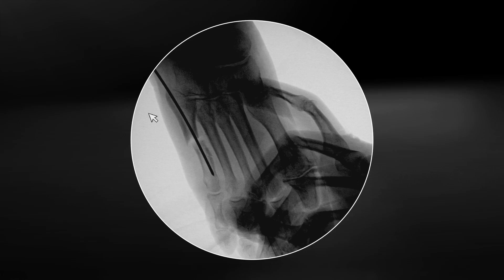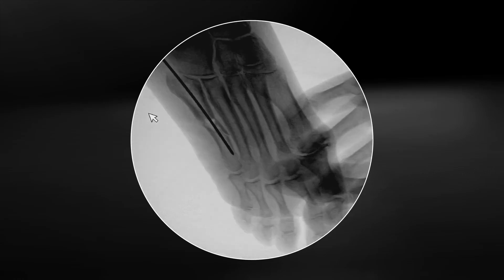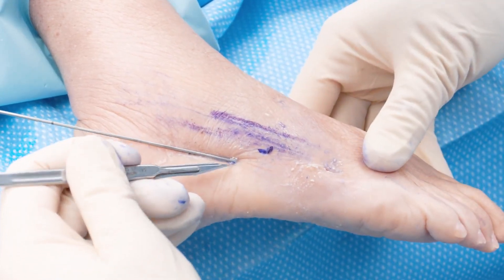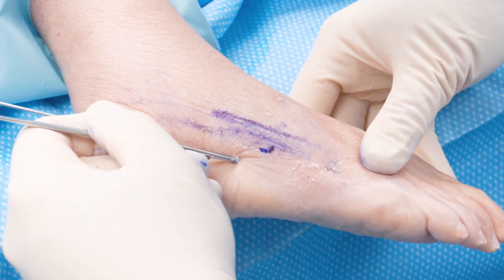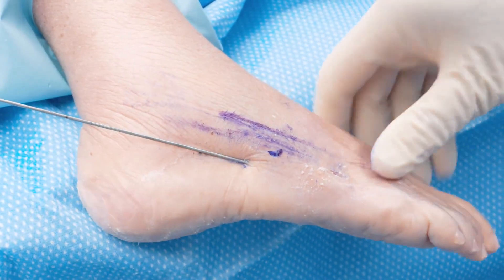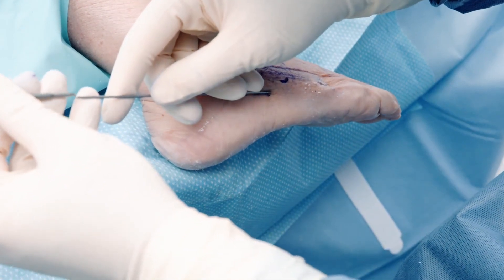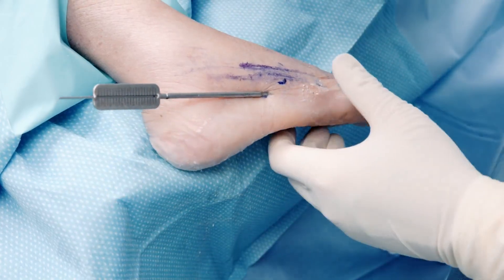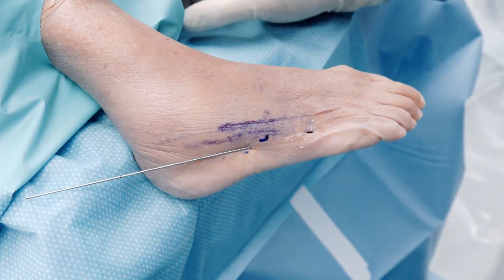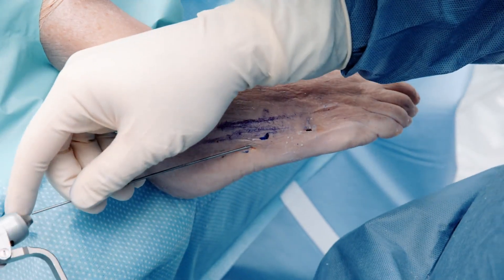We've got good correction and good position of the wire in this plane. Let's check the lateral — we've got good correction. You can see I actually cracked the dorsal cortex a little bit with my osteotomy, but we should get good adequate fixation distally without any problem. Now I'm going to use this wire as a guide for my incision — it minimizes trauma to the skin and enhances cosmesis. I'll take the back end of an 11 blade and push it down along the guide wire to the 5th metatarsal. Now we'll take our measuring device, beveled to allow us to more closely measure the appropriate depth, and check that the bevel is facing in the right direction. We've maintained our medial shift of the distal metatarsal, so I'm going to drive this wire out the tip — it's our guide for the screw and our provisional fixation.